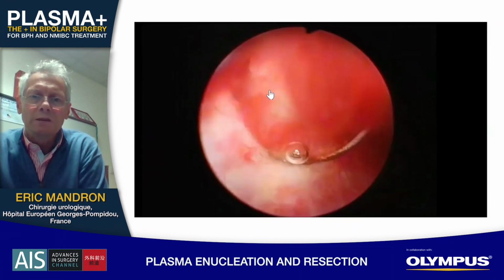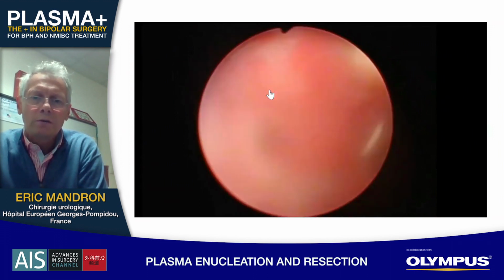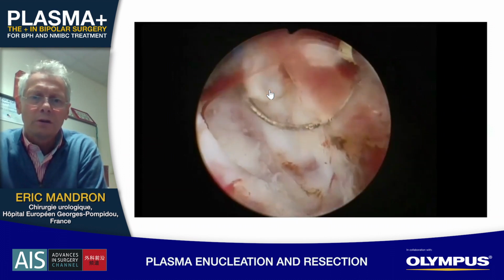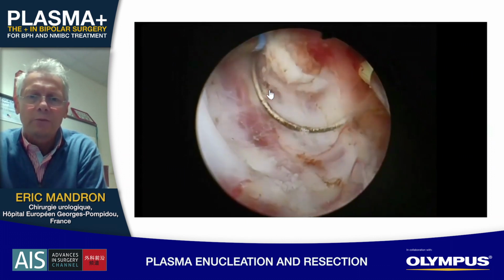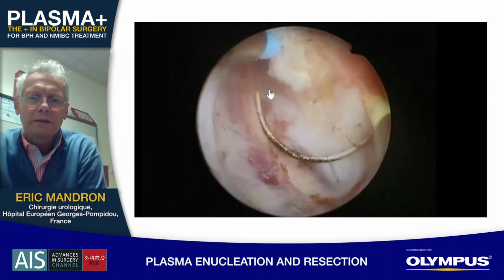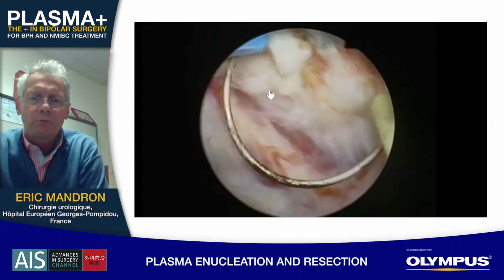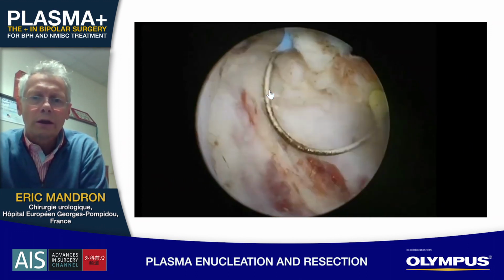do the incision, and immediately with coagulation we'll just have to do good coagulation. And then you will use the tip of your instrument, of the resector, just to find the layer and to lift. In fact, to lift up. You see very well here the beginning of the enucleation, and immediately when you see some bleeding, you just do the coagulation to have a perfect vision of what you are doing. So it's very, very important to go on and to see very well.